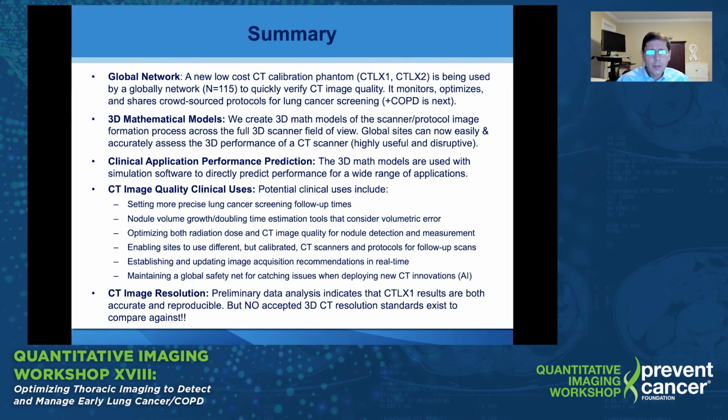So if I could leave you with one thing at the end of this talk, it is the absolute critical importance of establishing a worldwide 3D CT resolution standard so that clinical sites can verify that the scanners they've purchased achieve those results that the manufacturer provides, and studies and research can document the quality of their scans, at least in terms of 3D resolution. So that's the story.